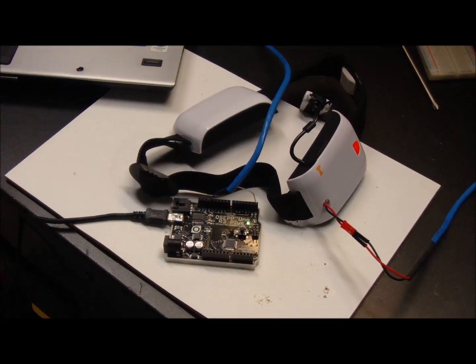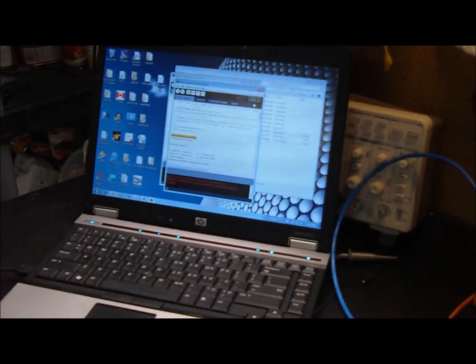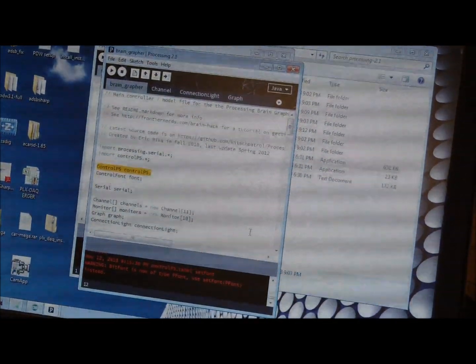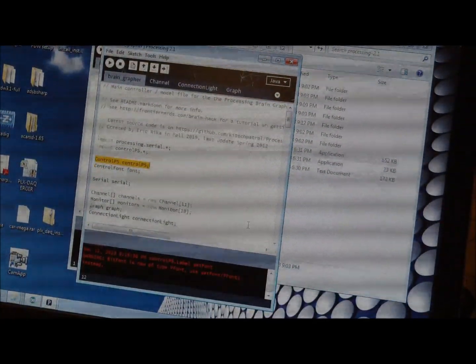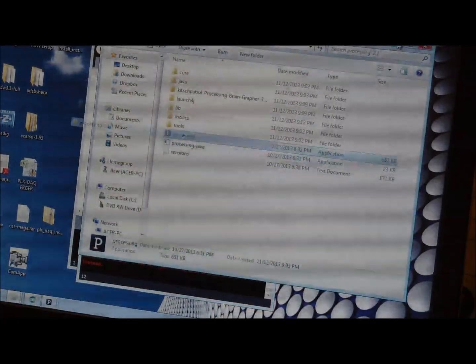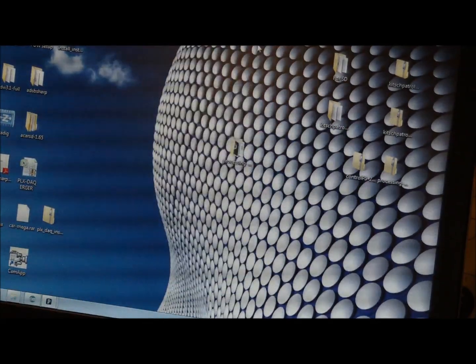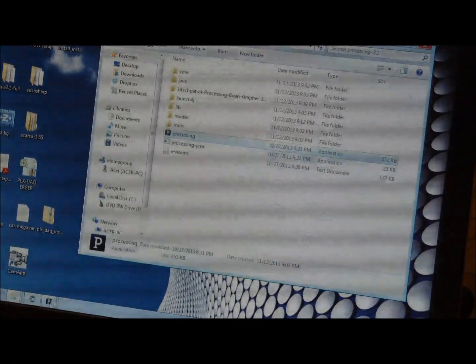So I haven't quite got the graphical version to work yet, but I thought I'd capture this before I forget, to save someone else the grief. What I did was I downloaded the brain grapher program and, bear with me, what's the name of the program again, downloaded Processing and the brain grapher sketch for it.